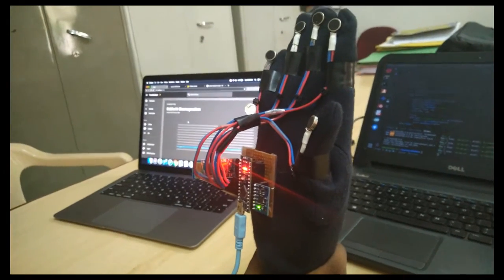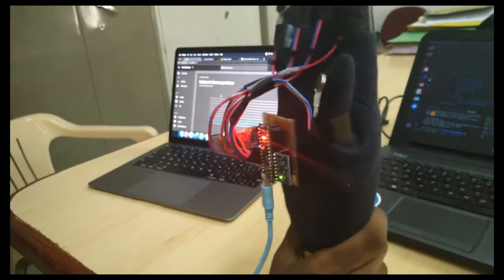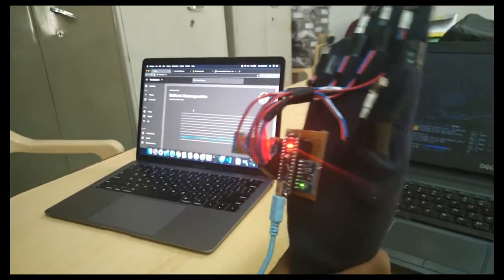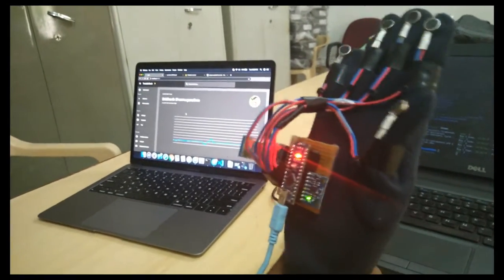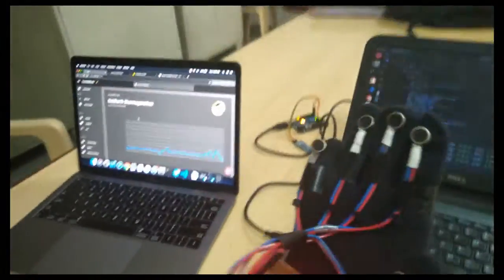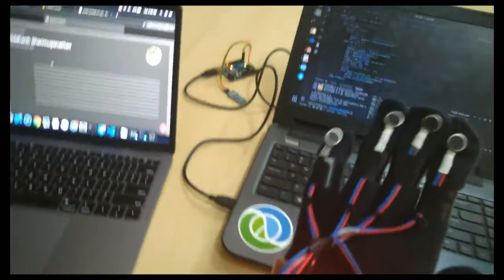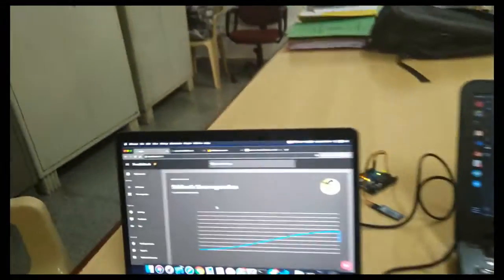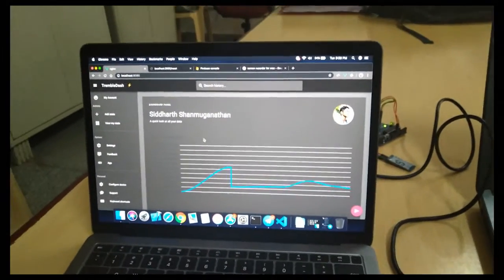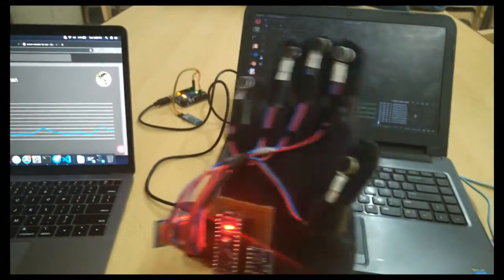Now what will happen is, I'm going to move the hand a little higher and lower, which means I'm going to simulate the tremor. The moment you simulate this tremor, our system will generate the counter vibration for it so as to control the tremor that is being triggered in the hand. That can be seen visually on the screen right now where the data generation happens. And one could feel it when they have it in the hand, they can definitely feel the vibration out of these coin motors that is being generated.